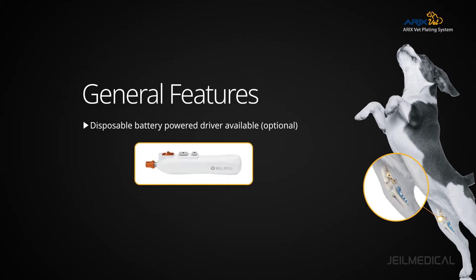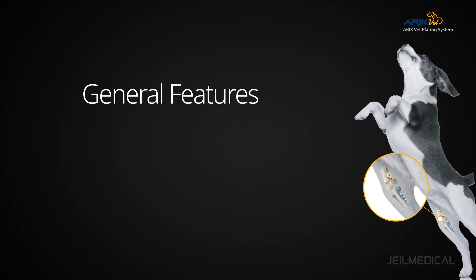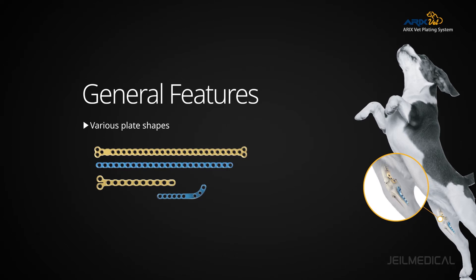The Smarto disposable battery-powered driver is available for quick and easy screw insertion. Various plate shapes enable optimal treatment according to symptoms.